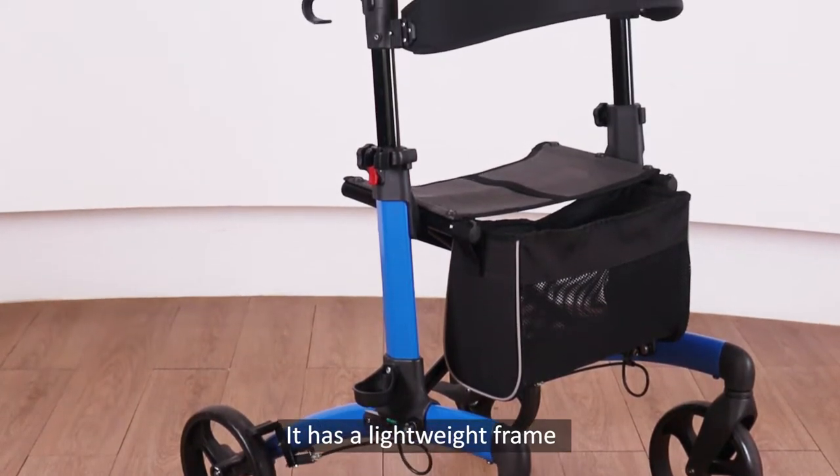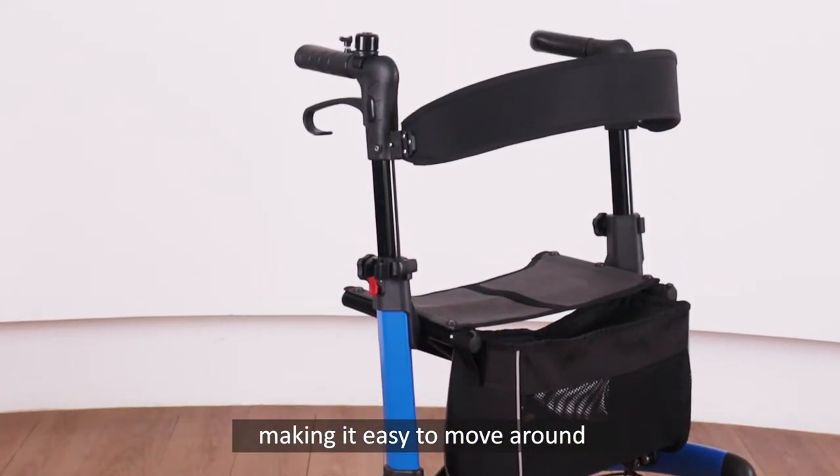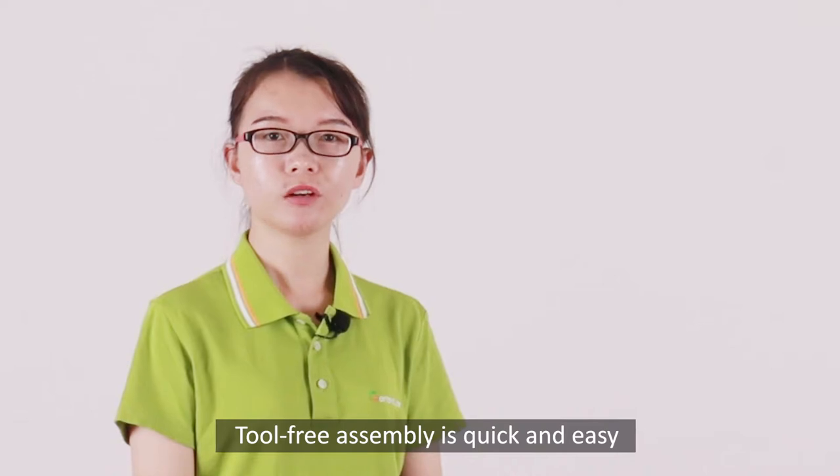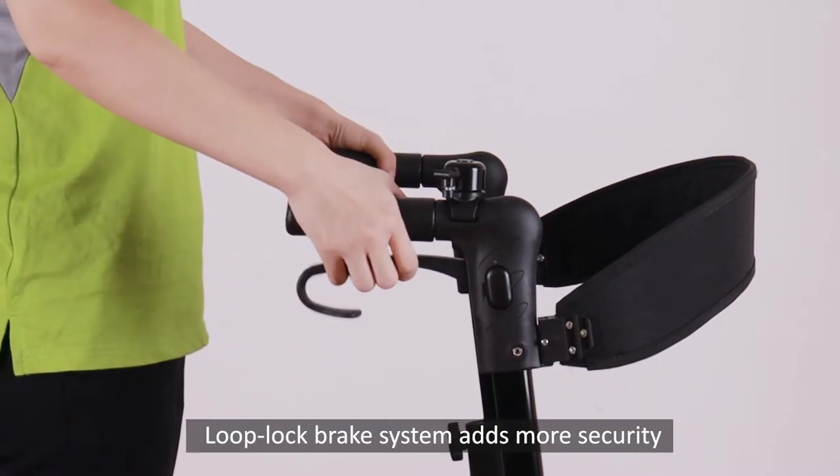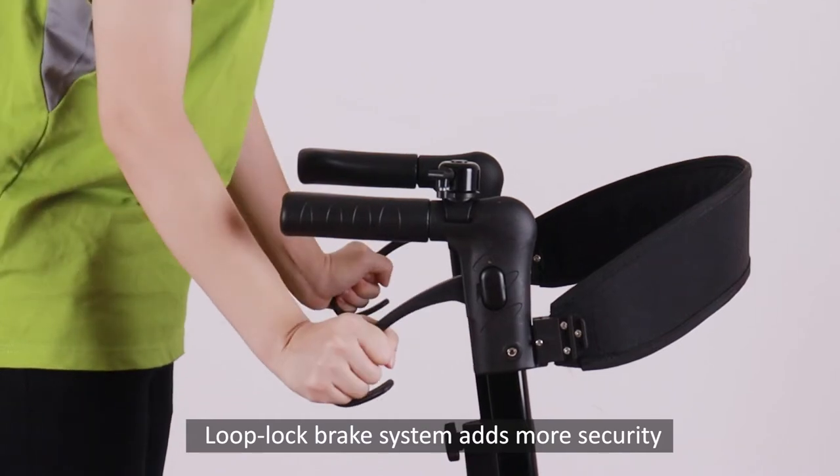It has a lightweight frame, making it easy to move around. Tool-free assembly is quick and easy. Loop-lock brake systems add more security.